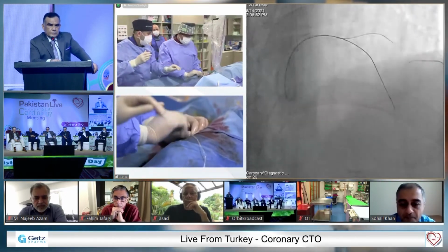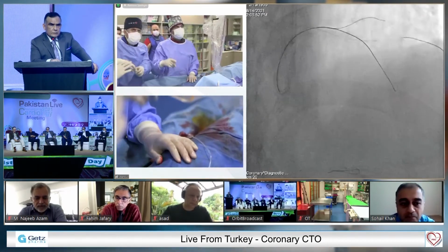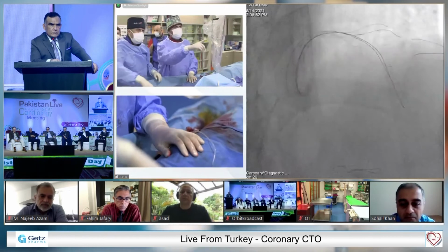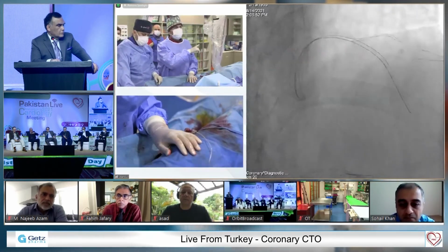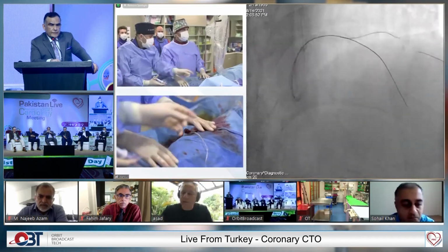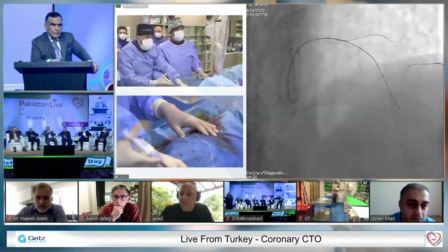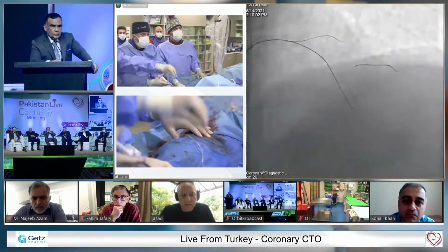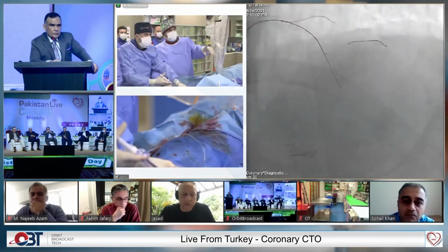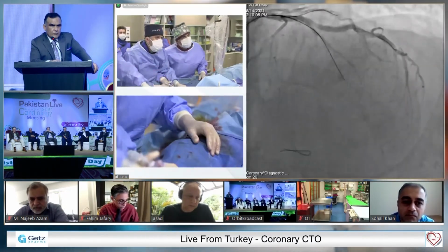Yes, the problem is that the distal vessel, when we see on the retrograde injection, if you use CrossBoss and Stingray, we take a high risk of losing the side branches. Yeah, absolutely. But in this case, since you're not really seeing any branches filling up, it will all be occluded. So even if you manage to cross true to true, it's quite unlikely to perfuse the branches.